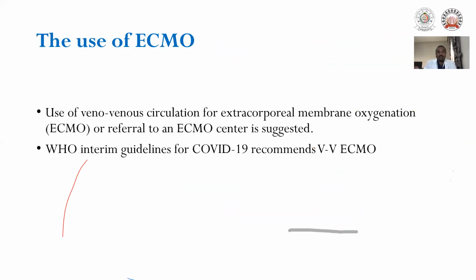Now coming to the ECMO. Okay, the role of ECMO in the management of COVID-19 is typically unclear at this point. It has been used in some patients with COVID-19 in China, but the detailed information is not available at all. The available evidence from a similar patient population suggests that carefully selected patients with ARDS who do not benefit from conventional treatment might be successfully supported with veno-venous ECMO. Okay, so it is similar to the previous evidence that we have.